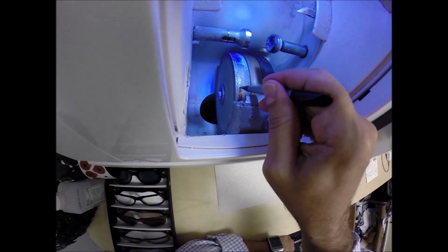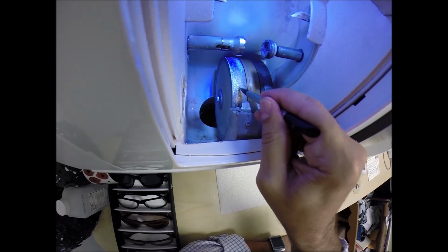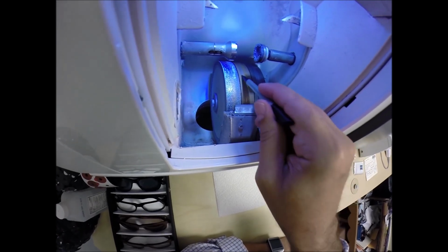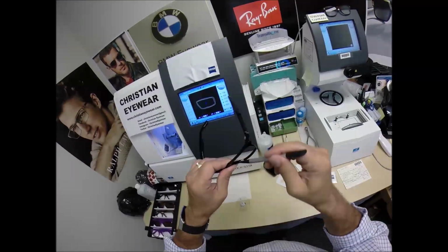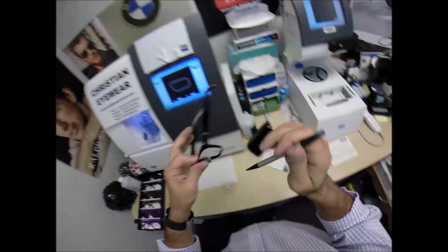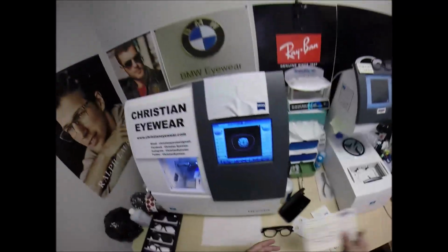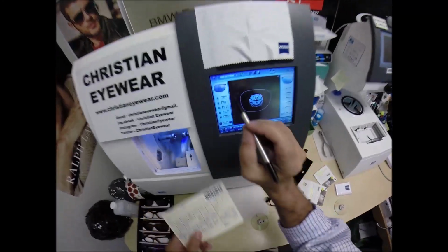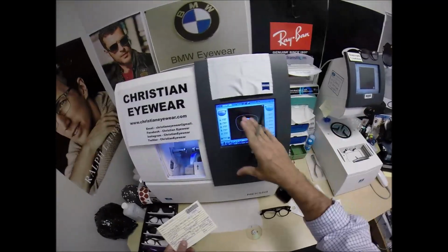The actual cutting wheel is this diamond crusted wheel that's going to grind away the lens material till it's the final size. This wheel in the center that has the V-shaped bevel is going to put the V-shaped bevel on the lens so it stays inside the bevel of the frame. Now I'm going to wake up the computer. This is job ID number 2842, so it's programmed. I've transferred the data from here to here.